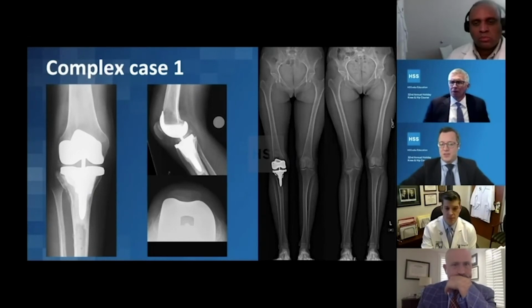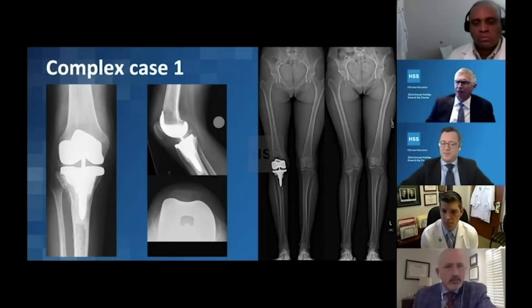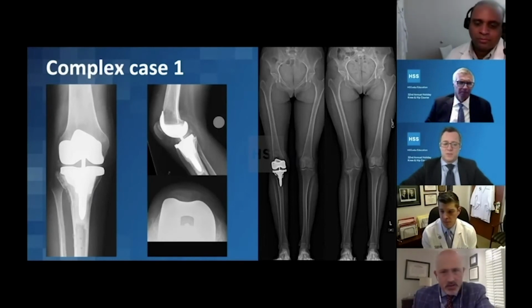Any thoughts on this reconstruction, guys? Overkill, maybe? You can't argue with biologic fixation. I don't think it's overkill at all. I think the extent of the defect probably dictated what you sort of had to do there, what you described. And so, no, I think it looks wonderful.